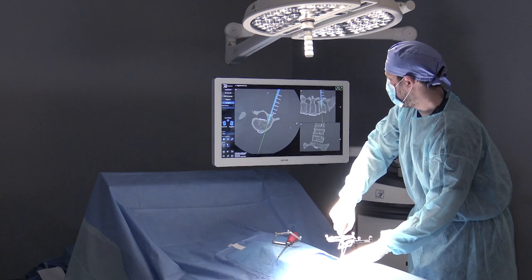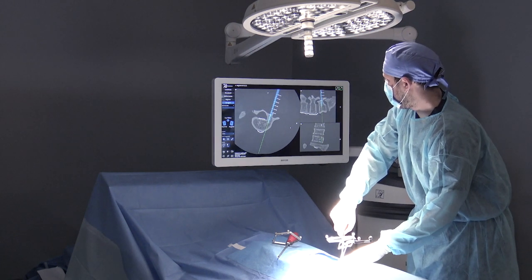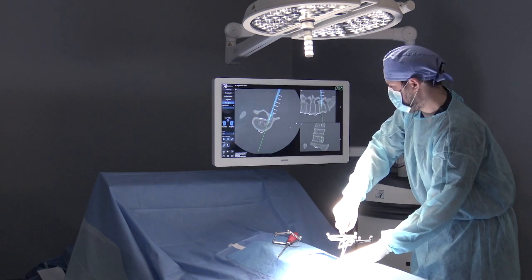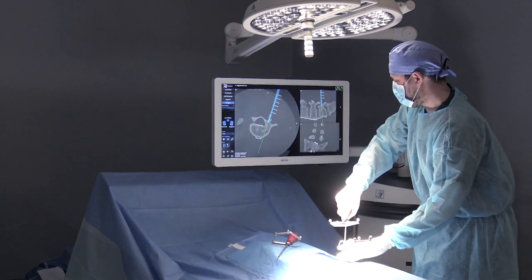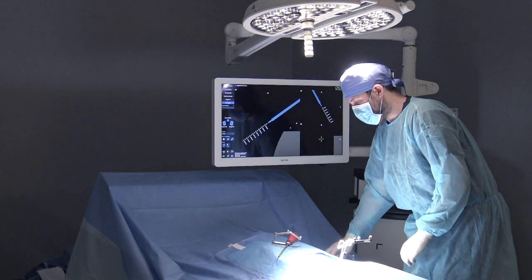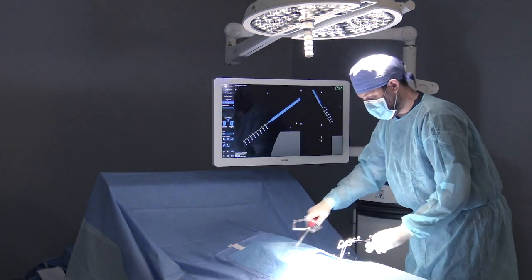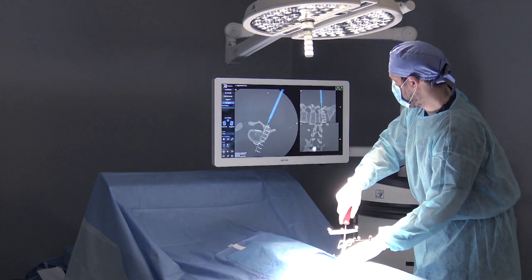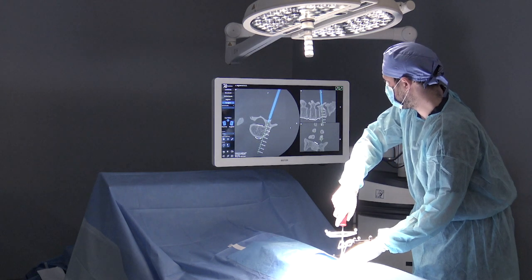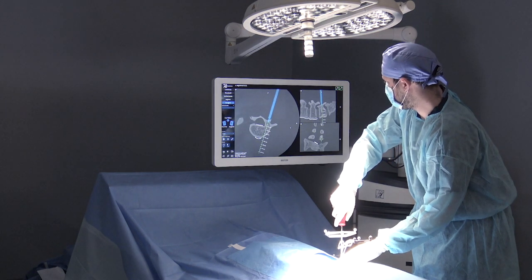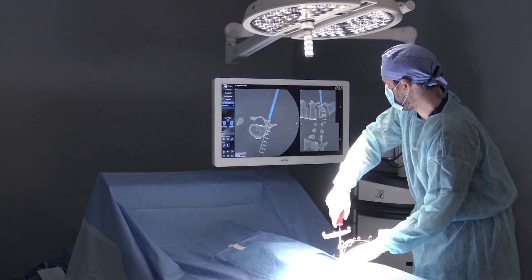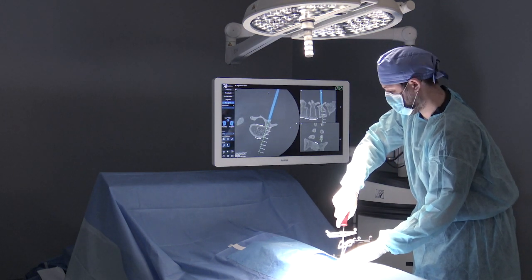This is the 7D Surgical System, the world's first machine vision image guidance platform for spinal surgery. Using technology similar to what is found in self-driving automobiles, the 7D system can easily register spinal anatomy in seconds without the need for intraoperative radiation.